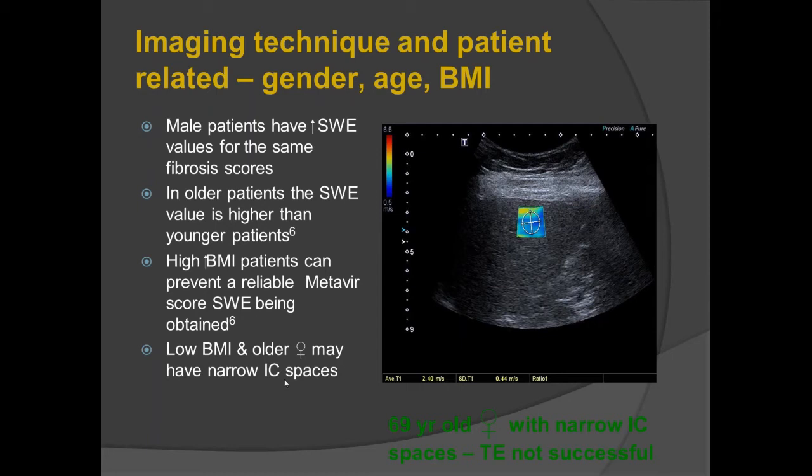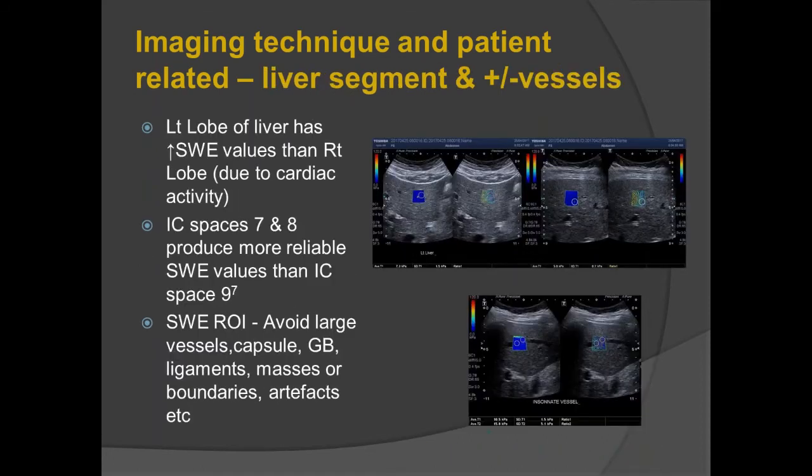And occasionally there are patients who, just like colour Doppler, just like other imaging tools, are just not suitable for elastography, particularly those with laboured respiration. And on those you have to say, I've got too high a standard deviation. It's always consistently above 20%, and I really just can't get a good elastogram.